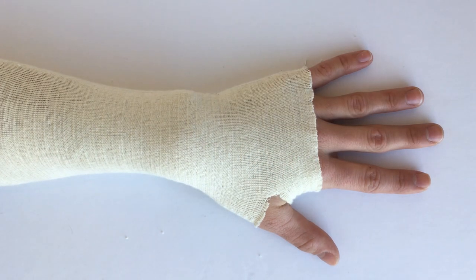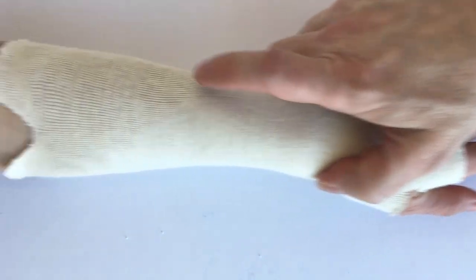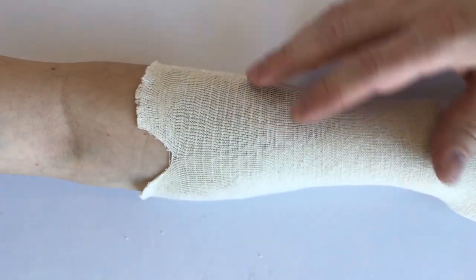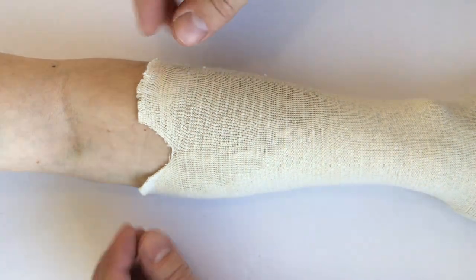One of the issues when using a compressive stocking like this is that what is good for the wrist may not be so good for the forearm if the forearm is a lot bigger. These typically come in one size.